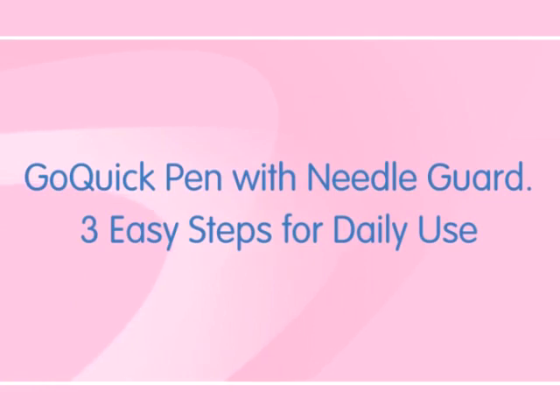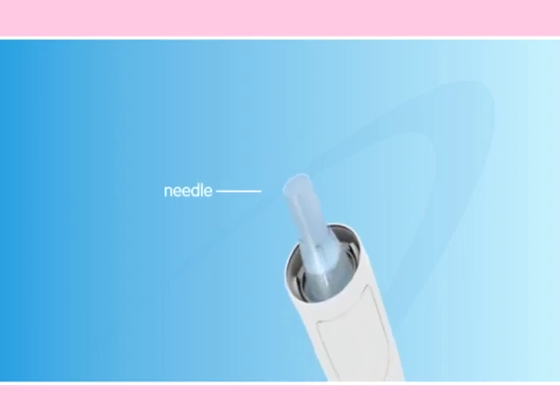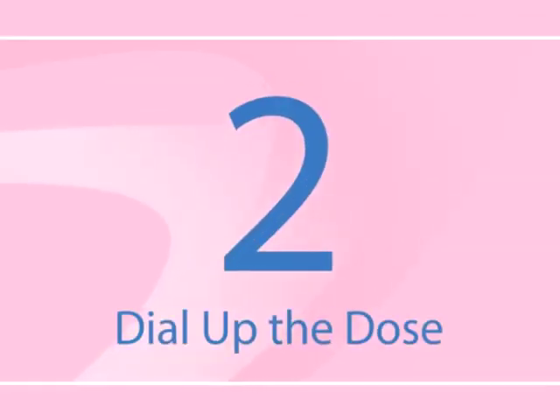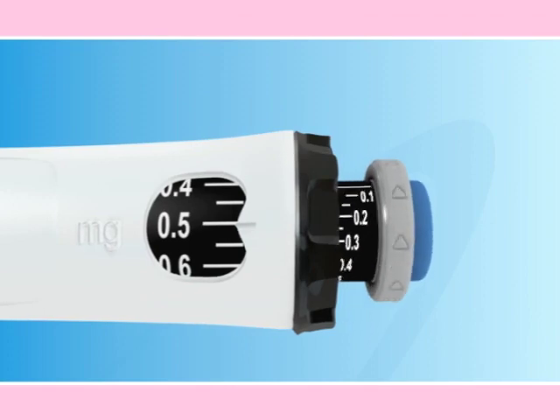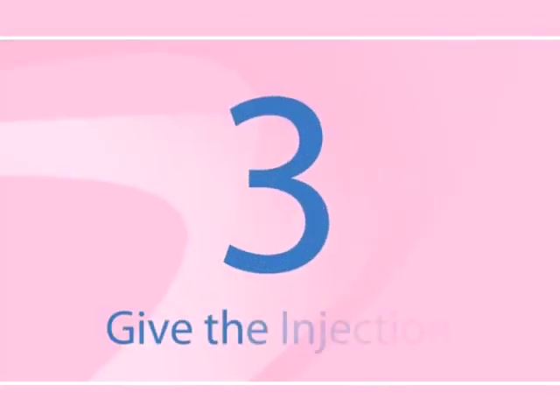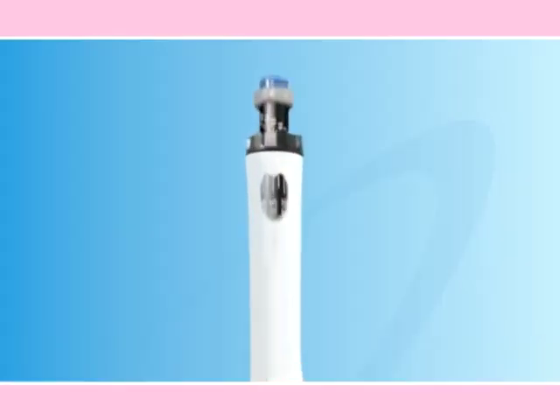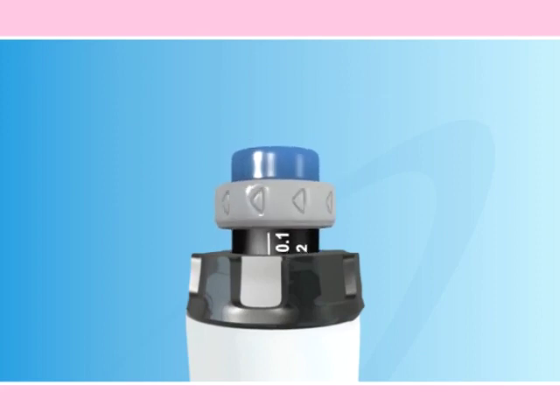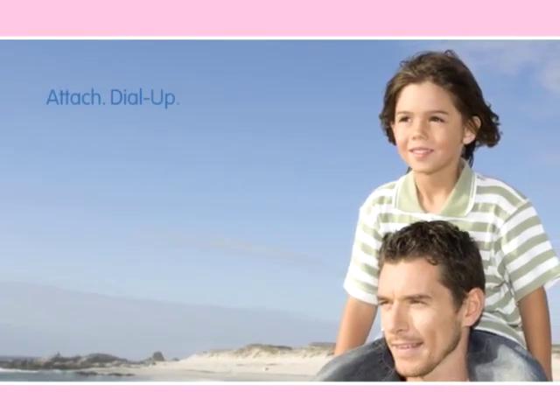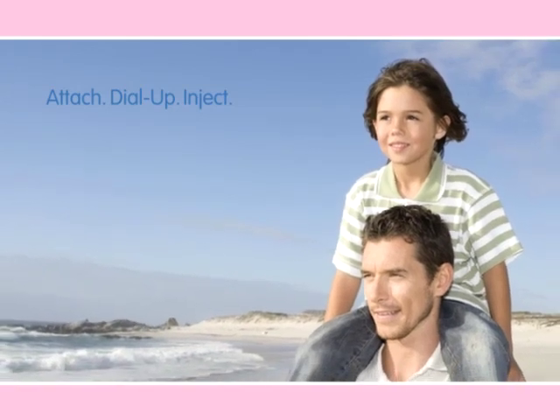The beauty of the Go Quick Pen is that once set up, it delivers the correct dose in three easy steps every day. First, attach the needle. Second, dial up the preset dose. And third, give the injection. Attach, dial up, inject — that's it. Simple to remember and simple to do.